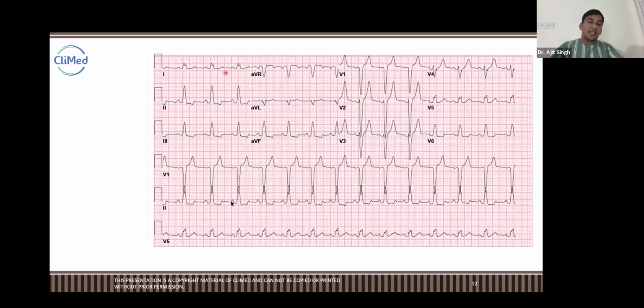The people who are thinking that after two ECGs I'll be teaching LBBB only are wrong. This is RBBB clearly. And see how many people have chosen LBBB. Almost everyone. 23 people have chosen LBBB, only 9 have chosen RBBB. How can you think it could be LBBB? First of all, tell me.